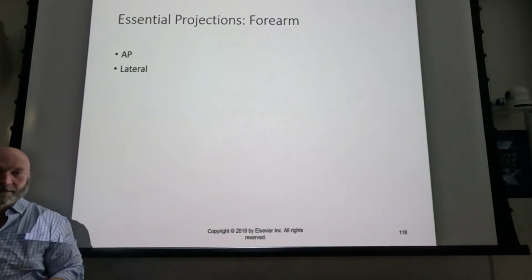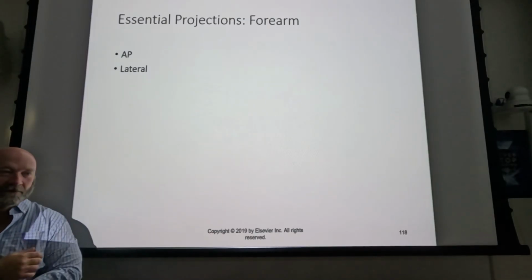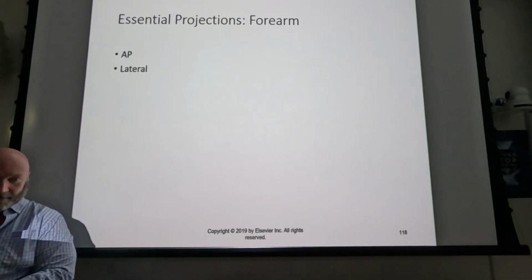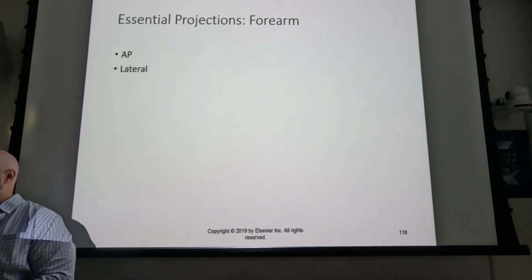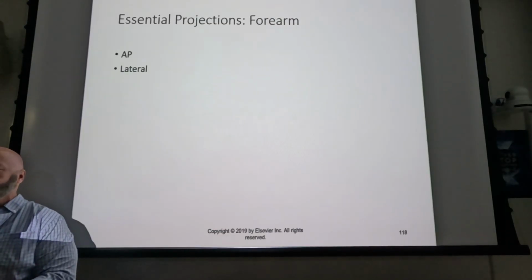patient's going to always ask you, is it broken? They're always going to ask you. You have to tell them the doctor's got to make the diagnosis, right? But you're going to see an obvious fracture. I mean, obvious fractures are obvious, right?